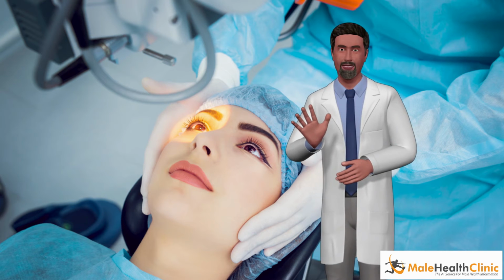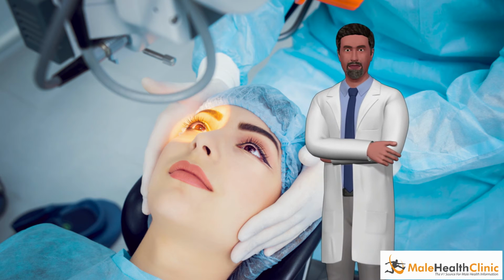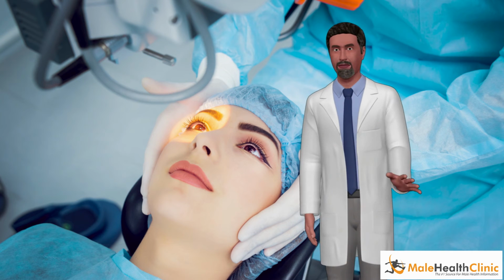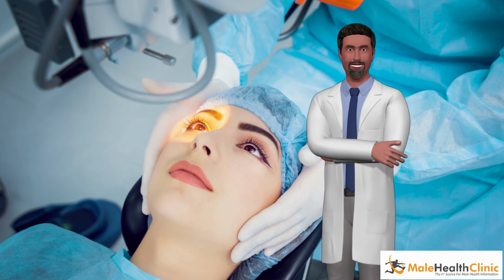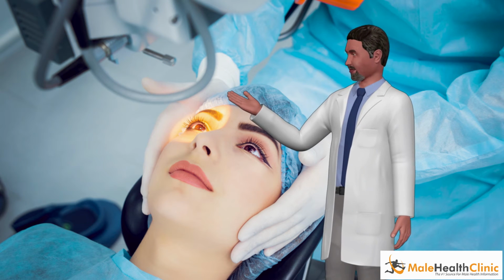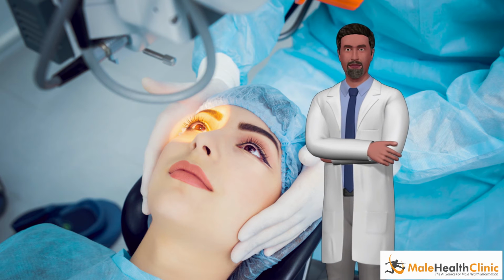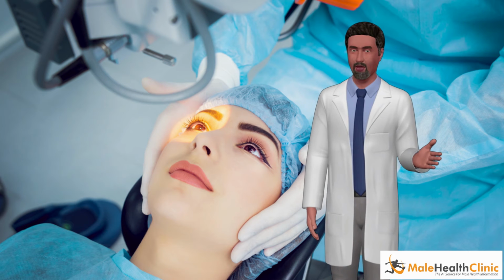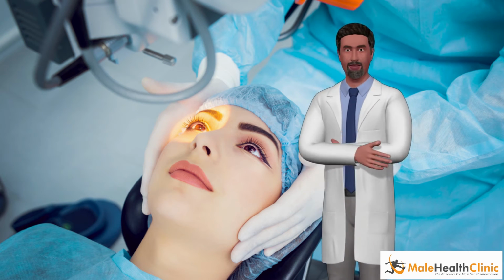Next, a flap is cut into the cornea, leaving a small hinge to keep it attached to the eye. This flap may be made using a small razor-sharp knife called a microkeratome, or by using a laser, also called intralase. The suction ring serves as a precise guide for the microkeratome to ensure that the flap is made cleanly and accurately. After the cut has been made, the suction ring is removed and the flap is gently teased away from the cornea and peeled back, towards the hinge, to reveal the underlying stroma.